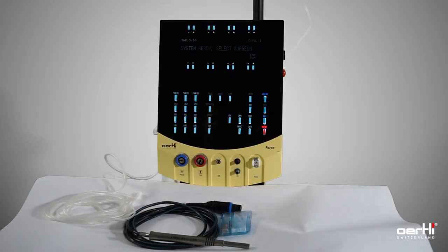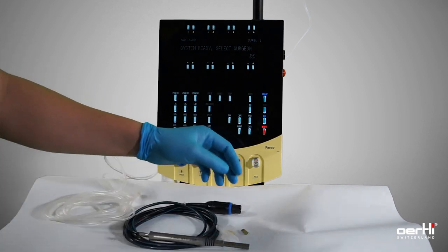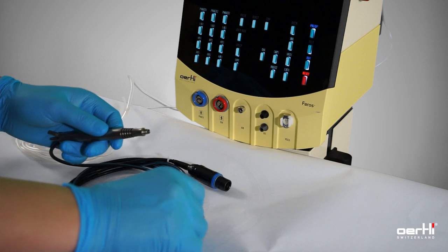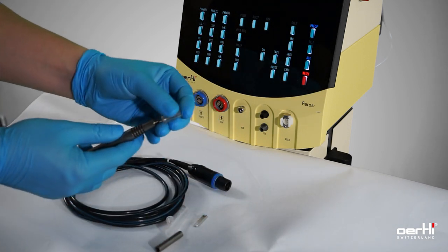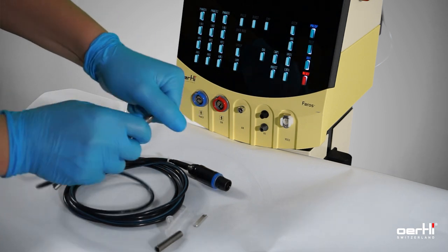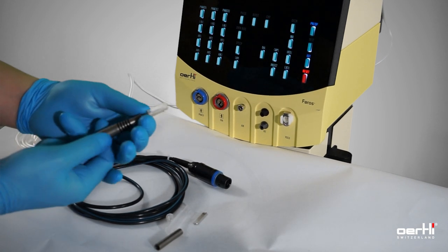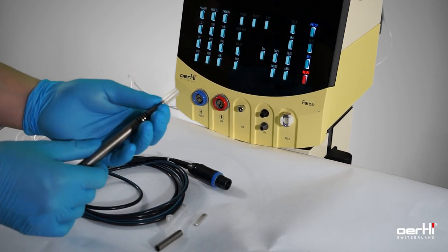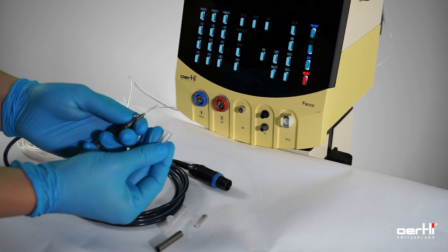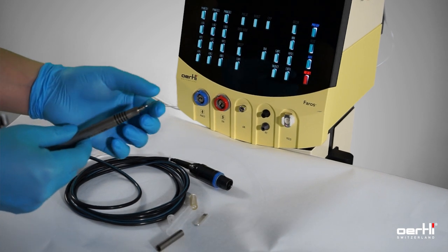Go ahead with the FACO handpiece. Unpack the FACO tip and remove the cover. Assemble the FACO tip with the handpiece — all the way down, make it tight. For removing the cap, use your pointer and thumb in between the cover and the handpiece. With the other hand, support the cover and remove it gently. That prevents any bendings or damages on the tip.